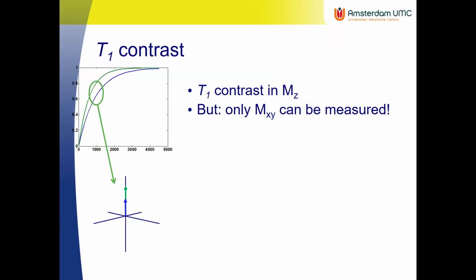Now there is an issue, because this talks about longitudinal relaxation, so the signal recovering, the spins or protons aligning with the field, or the compass needles aligning back with the field after I disturb them with the RF excitation.